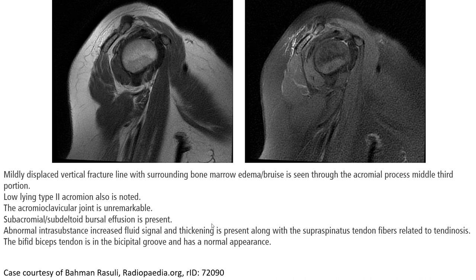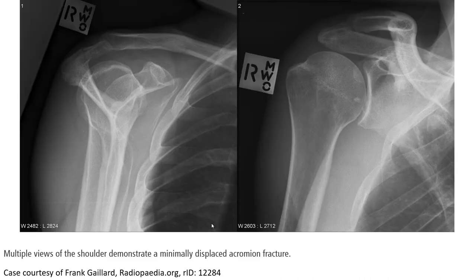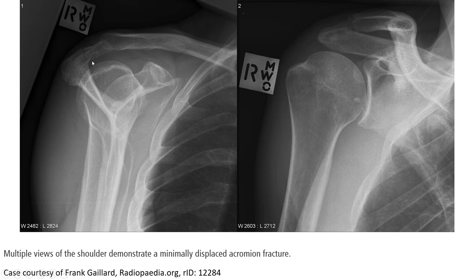The biceps tendon is in the bicipital groove and has a normal appearance. This X-ray, a multi-view of the shoulder, demonstrates a minimally displaced acromial fracture. As you can see very clearly, a fracture line is visualised across the acromial process.